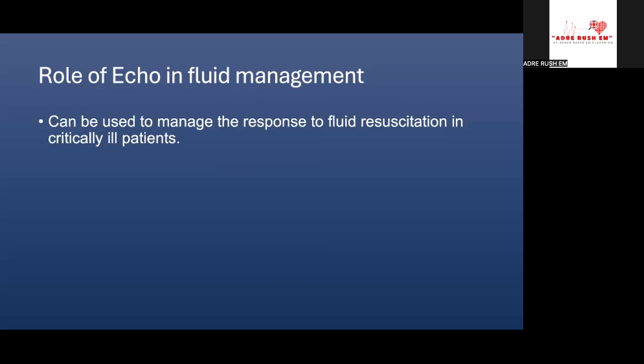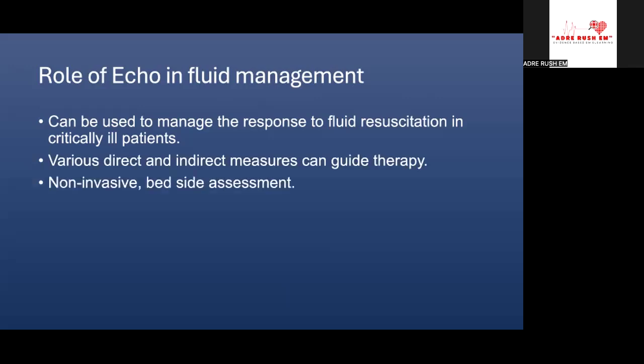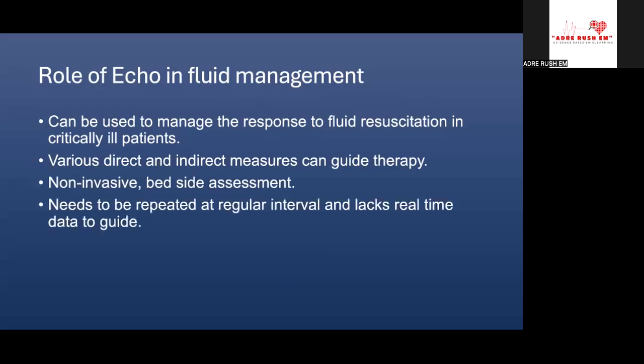Echo can be used to monitor the response to fluid resuscitation. You have various direct and indirect measures to guide our therapy. It is an easily available, non-invasive bedside assessment tool. It can be repeated at regular intervals, and this is a good thing as well as a flaw, where I can't have a real-time guide or data like we get in our cardiac output monitors. It's very subjective. What I see, what I assess might not be reproducible when another person repeats it.